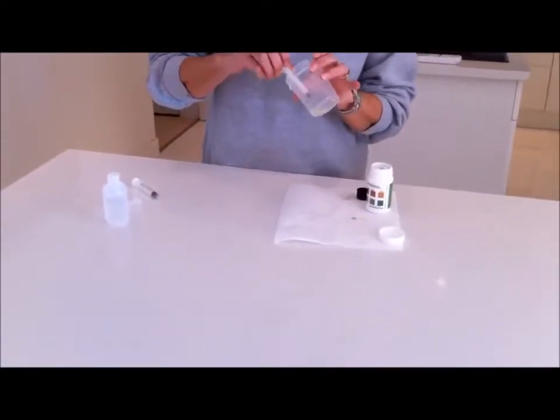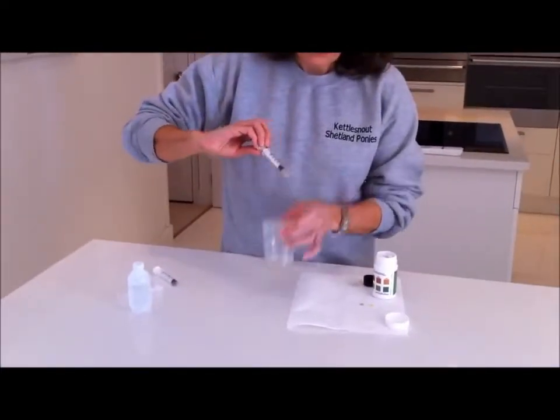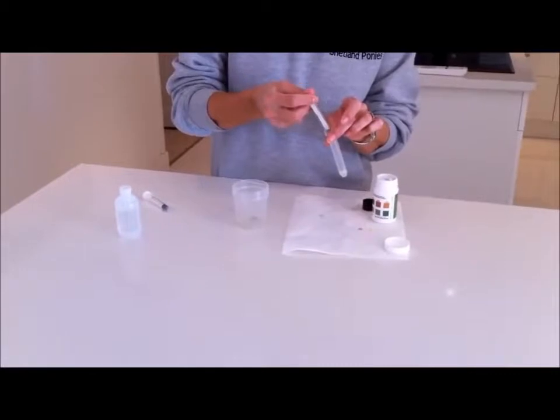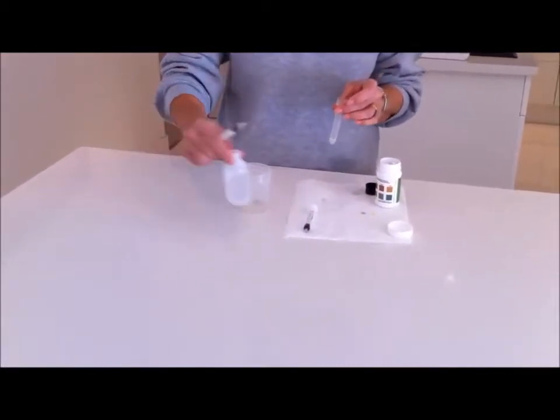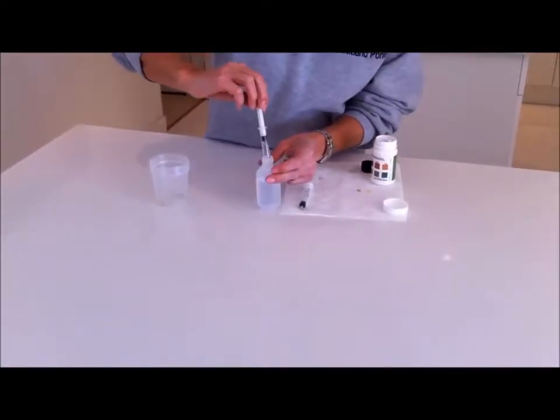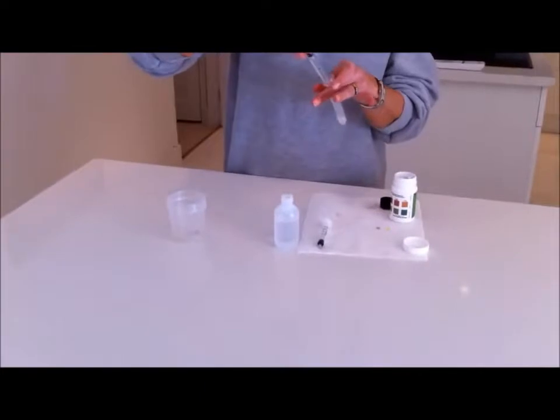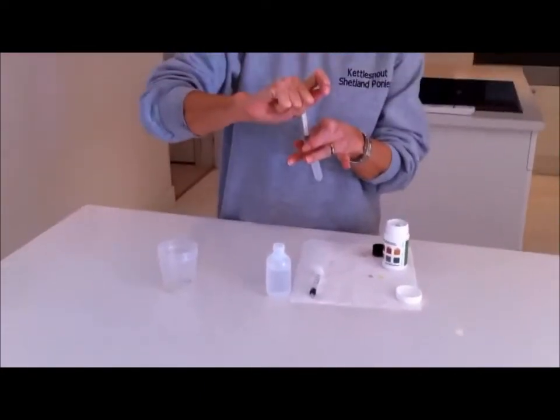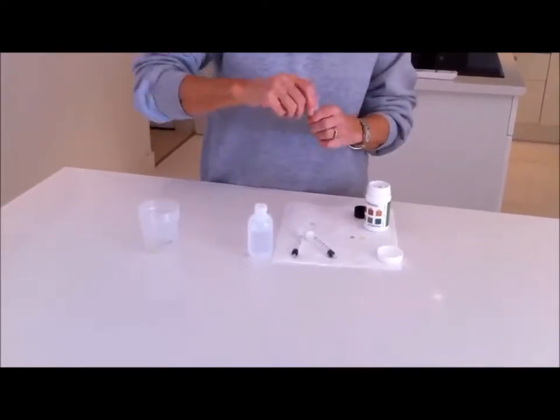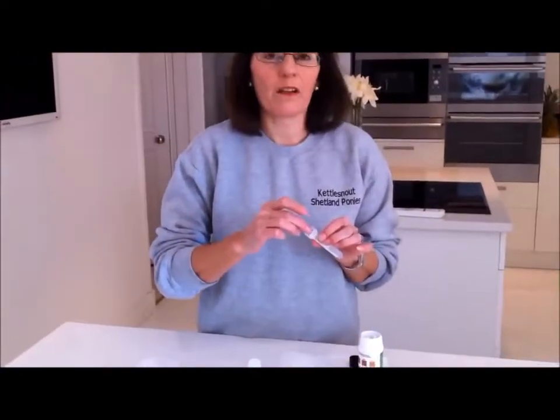So here's Rosie's milk. We take our three-mil syringe — all we need is half a mil. Put that in the test tube, then with a clean syringe we add three mils of distilled water. Put that in the milk and add a little bit more, then give it a shake. Take the test strip and put it in the milk for ten seconds.